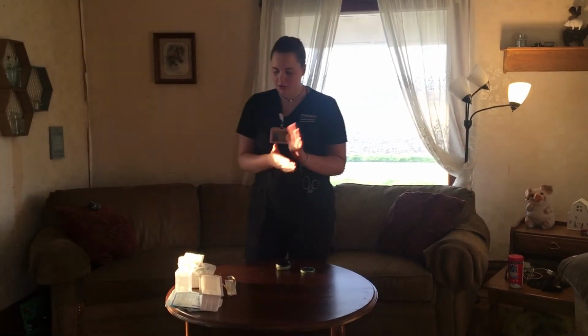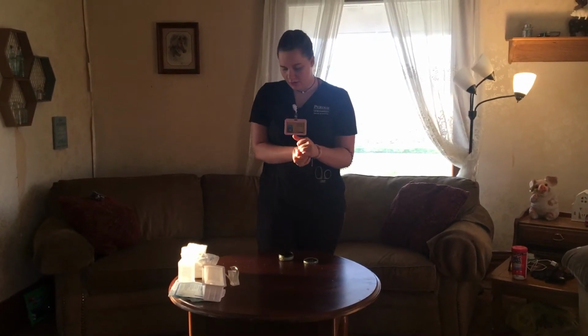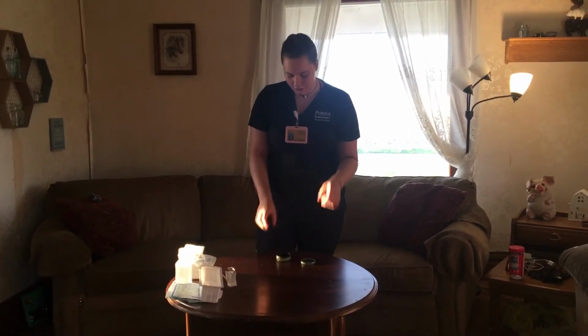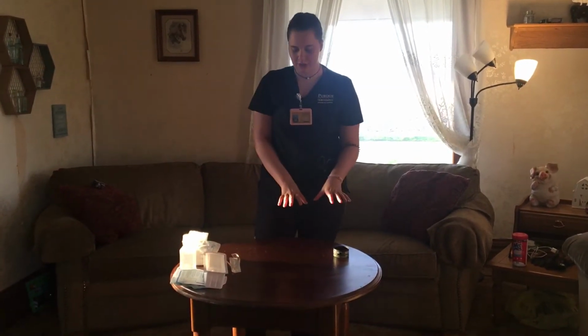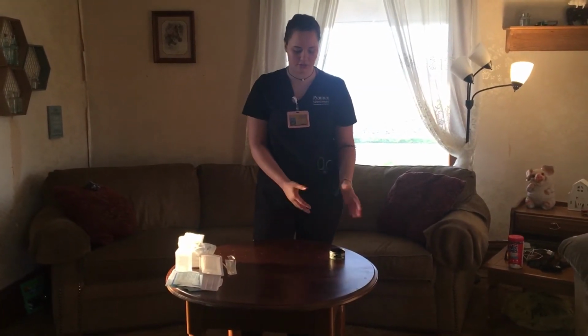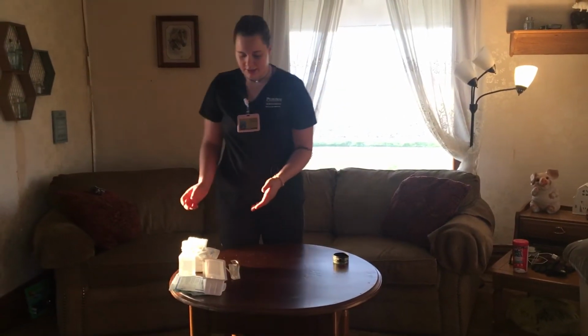discard those, perform hand hygiene, and then we're going to go ahead and set up our sterile field at this time. And you want to also check, after you take the old dressing off, you want to check the drainage tubes and everything too, if there are any, for anything like that.